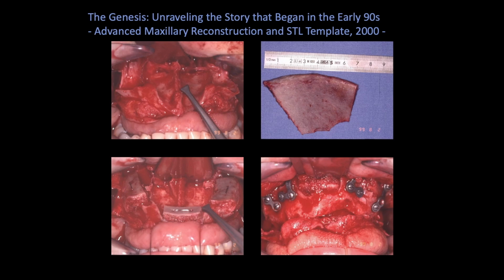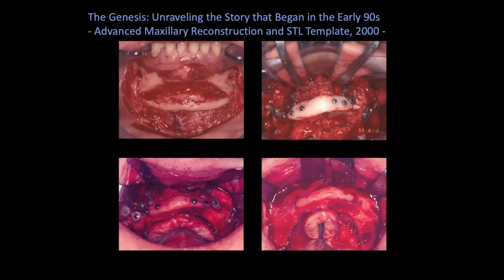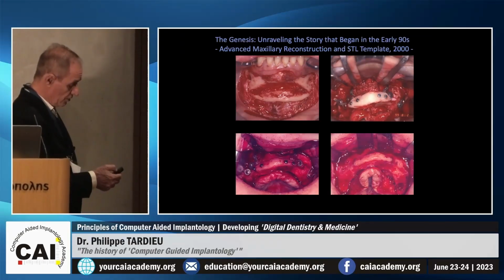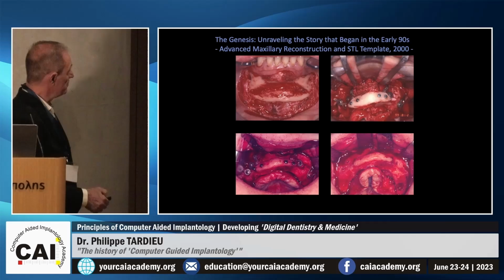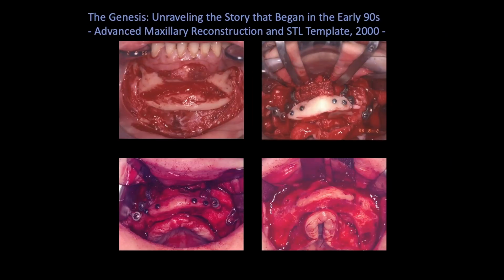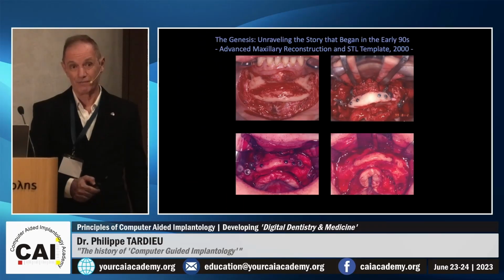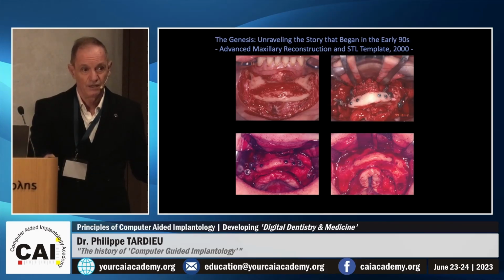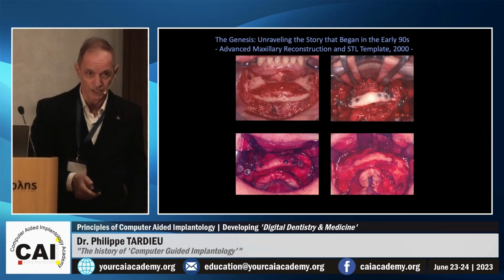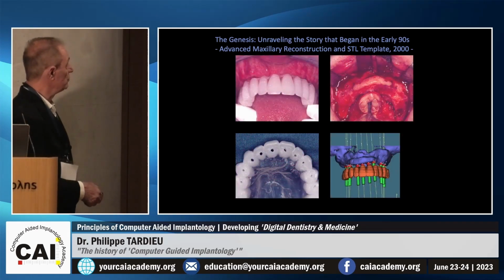They need to bring step by step new things. So to have the same curve at the upper and the lower, he's been harvesting bone, and he's basically placing bone at the bottom here. He's been taking it on top. So a few months after, I removed the screws. Today, I would not remove the screws, but at that time, I thought that we could avoid scattered images by leaving the screws out. So I removed them, but I guess it's a mistake that we made. We didn't need to do that.